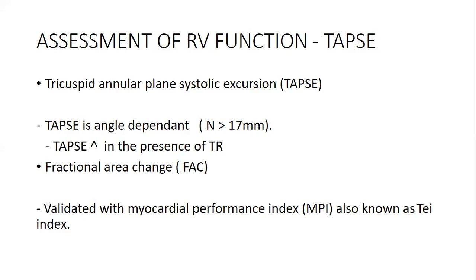And then half the time, sometimes we don't even quantify the function of the right ventricle. You also agree with me that cardiac sonographers, we've been using surrogate parameters to quantify the right ventricle function. Sometimes we just look at it, eyeballing, and then we confirm what is there. But the key message here is that we can use a few parameters that can help us to see the quantification.